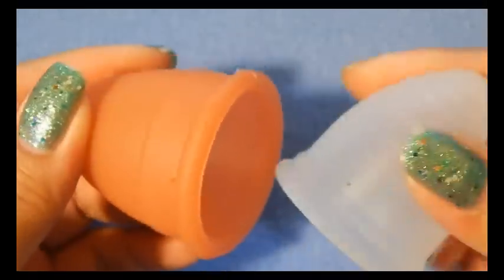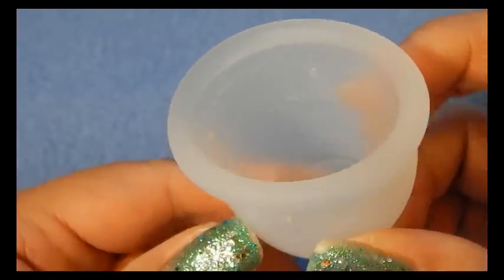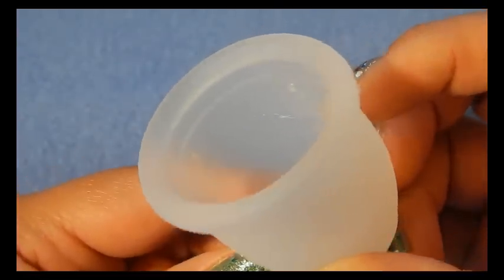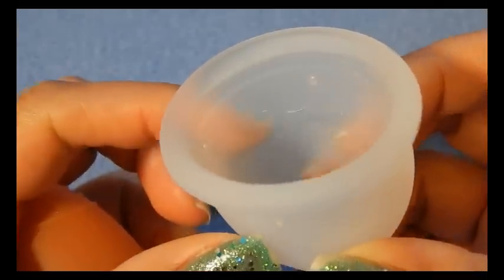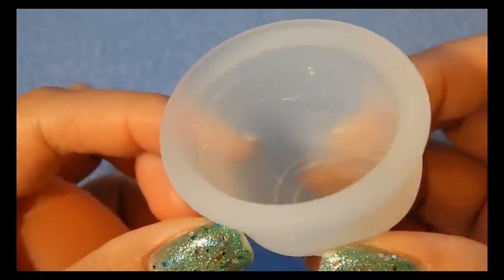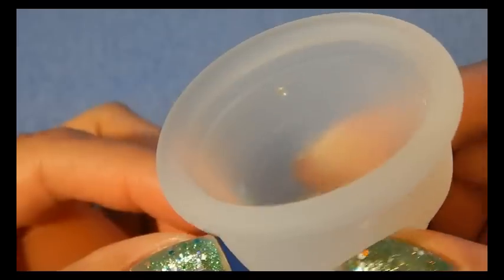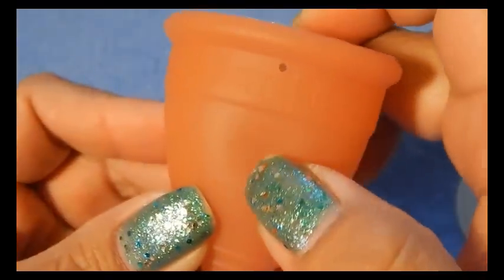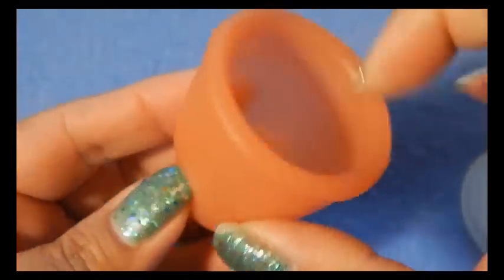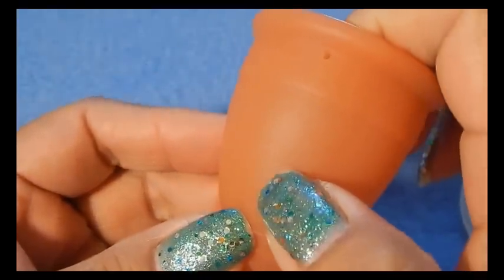With the markings, the Ruby cup has measurement markings and numbers on both sides of the cup. The Lunette only has some measurement lines but there are no numbers, and they're only molded on the outside.